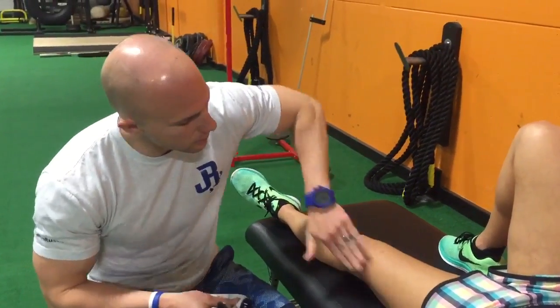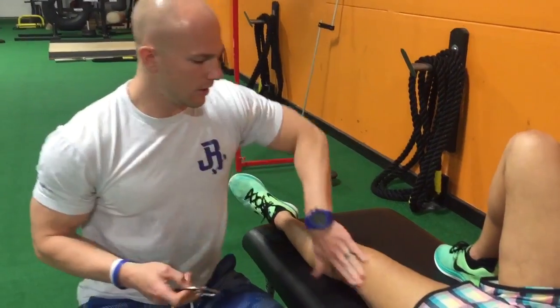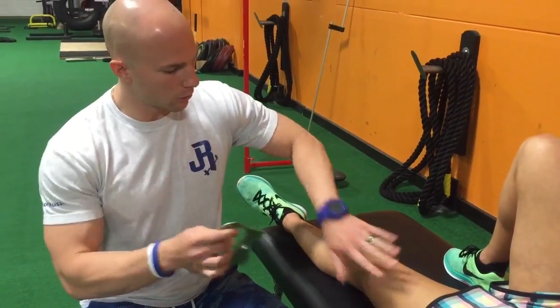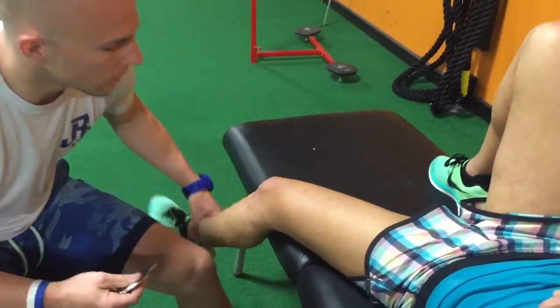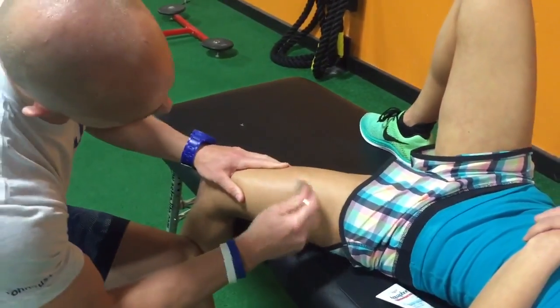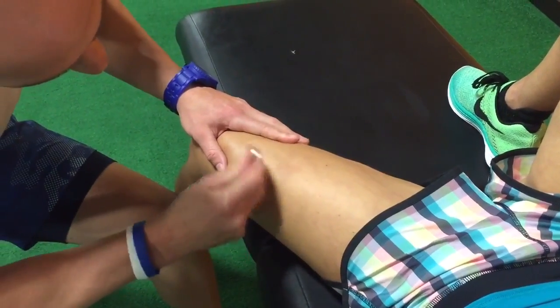We're going to get this area lubed up, and using the tool, you're going to match the side of the tool with the congruency of the tissues. And Lindsay, can you bring your leg off to this side — we're basically going to be going down very lightly and treating the underlying tissues.